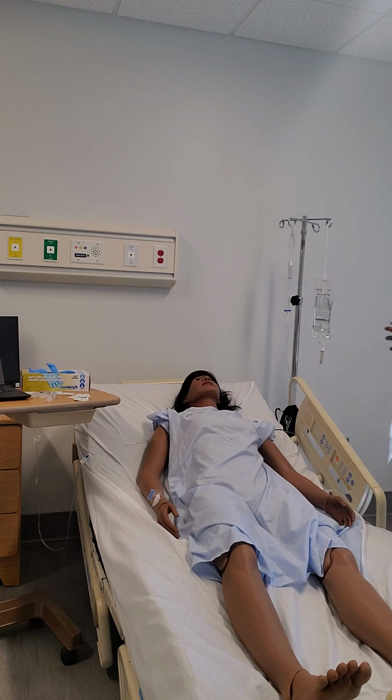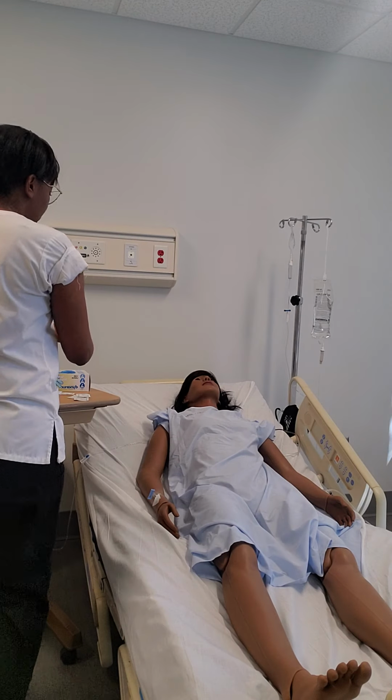Before we administer that, I'd like to ask if you have any allergies to any medications. If the patient does have allergies, I compare it on the wristband and find out what the reaction is to that allergen. I'd also ask if the patient was diabetic. I'm doing hand hygiene.